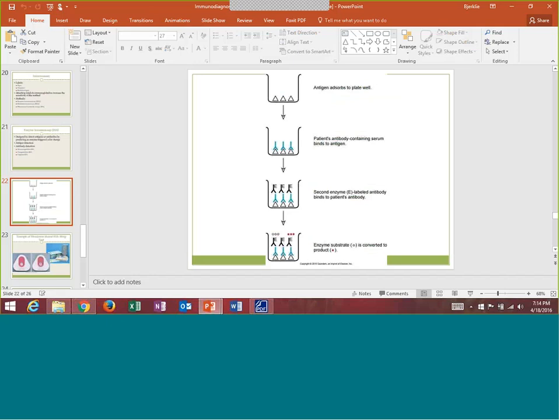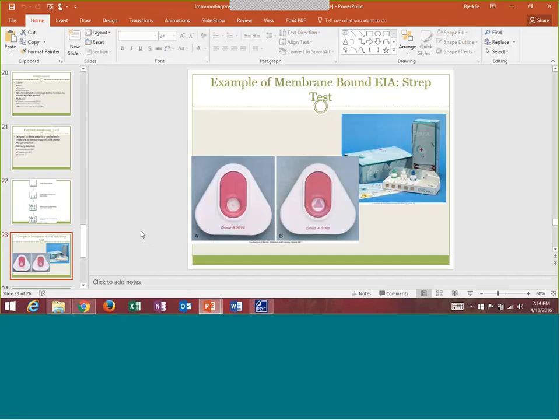They will bind together, and you don't know it yet. It doesn't make any clumping or anything. It just sits there, so you can't see it. But when you add a second antibody with the enzyme color on there, then it will form a color letting you know, yep, it was there. So it's great; strep test kits use this. If you look here, letter A is negative. You see there's no color reaction, nothing happened. Letter B shows you how the color change can work to show you a positive result.